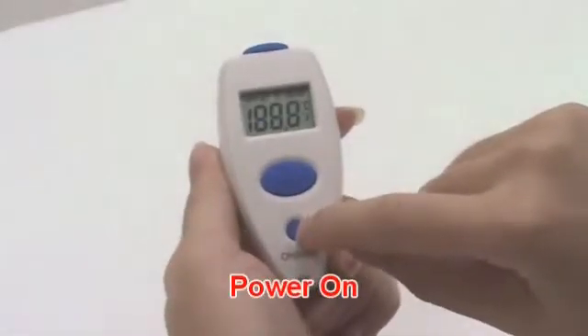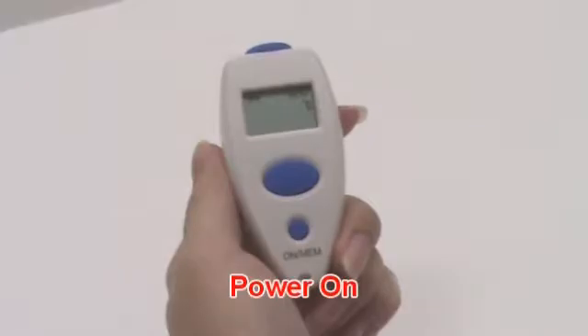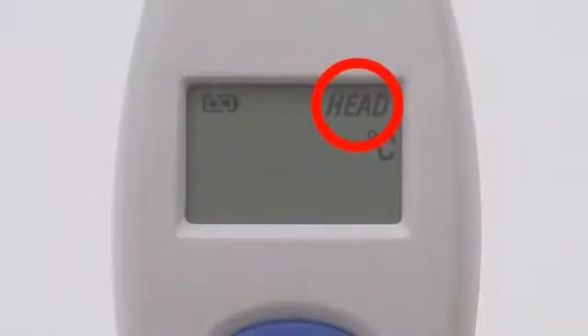Press the memory button to power on. The thermometer is ready for use after the head icon stops flashing and you hear two beep sounds.